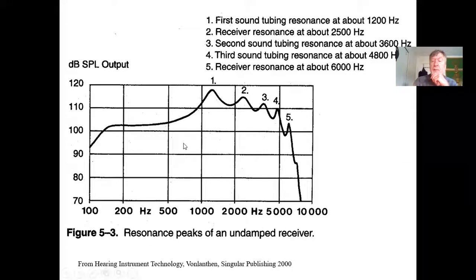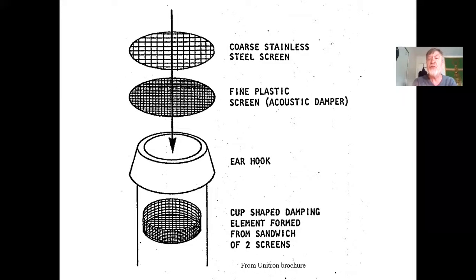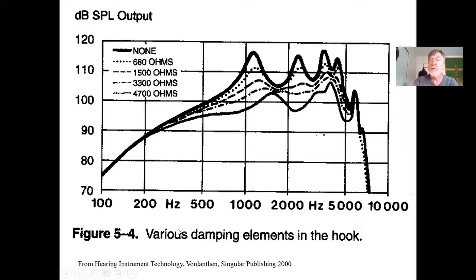Filters are little screens placed into the ear hook of the hearing aid. Here you can see an actual filter — a tiny red screen inside the ear hook. You can have a coarse screen or a fine screen inserted into the ear hook.